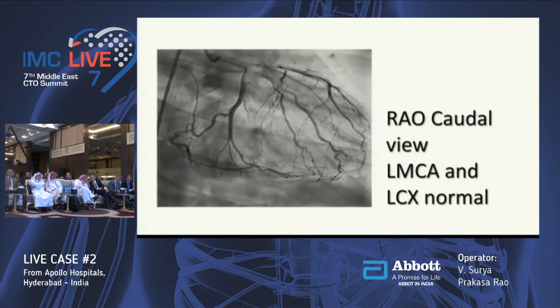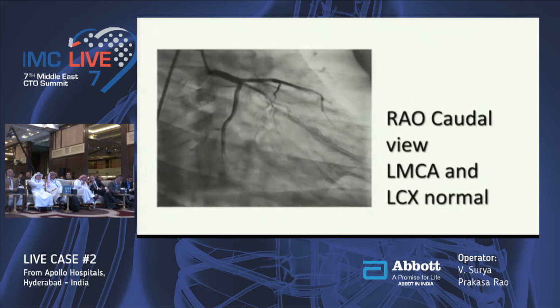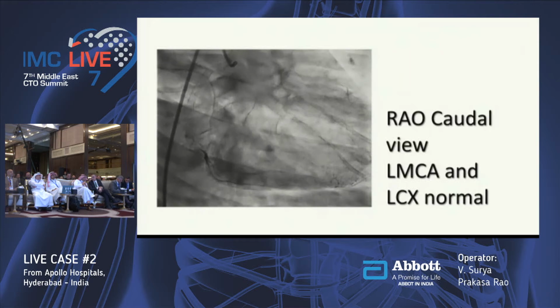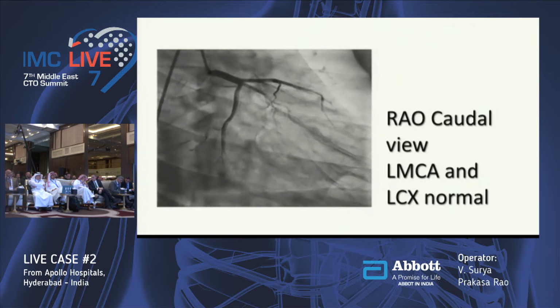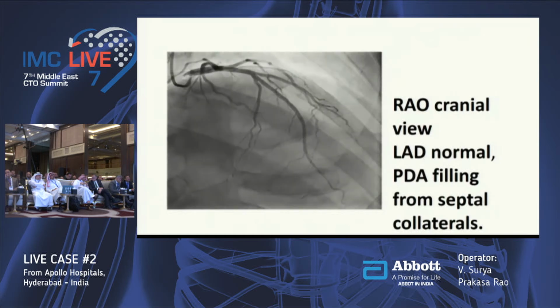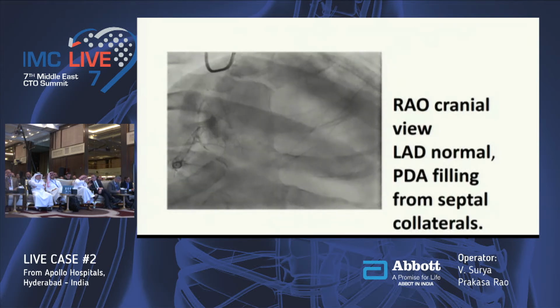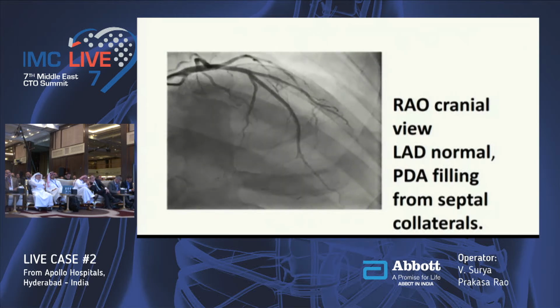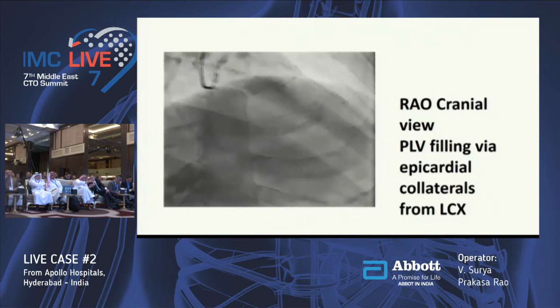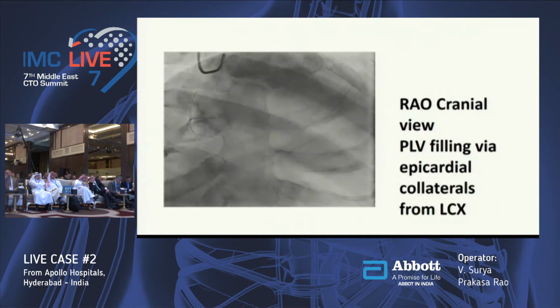Okay, so I think it's RCA occlusion. Okay, next. Very beautiful collaterals from the septal. Okay, next.